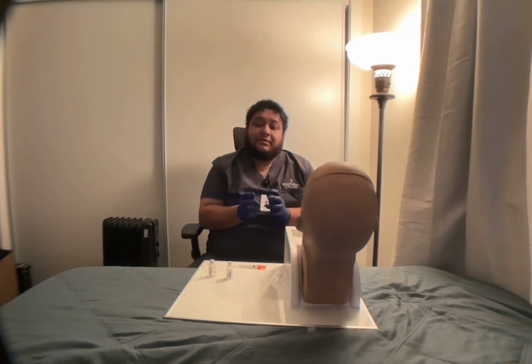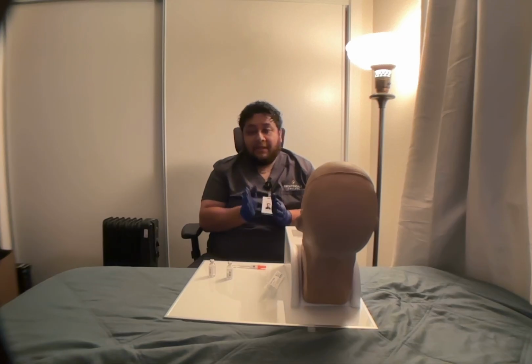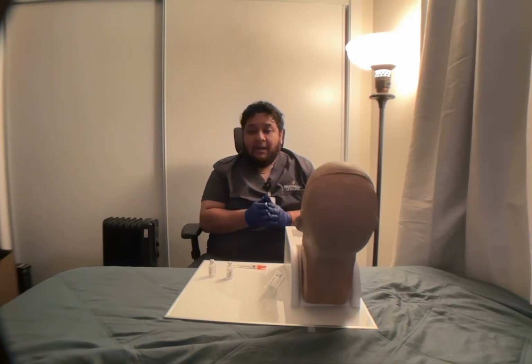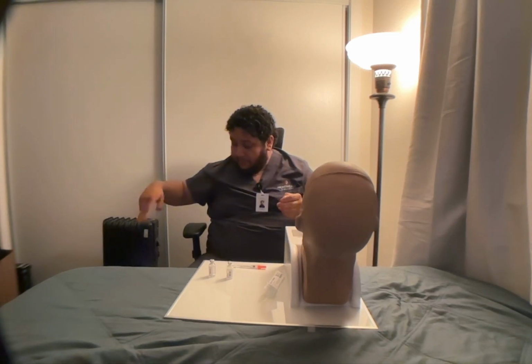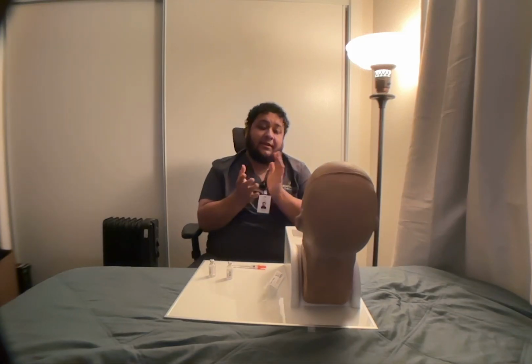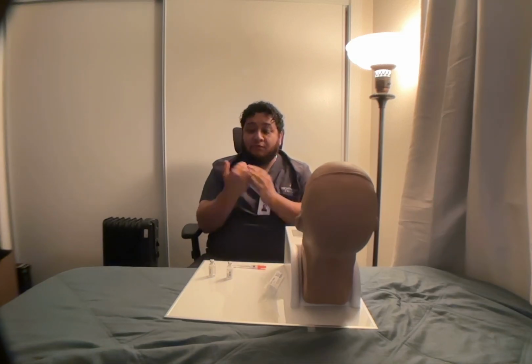Since the insulin was prepared away from the bedside, I'm going to label the syringe with the right name and dose, and dispose of the supplies properly. Then I'm going to remove my gloves and perform hand hygiene. Now I'm going to ensure that the patient is comfortable. I'm going to give him the call light and ask him if he has any other questions for me before I exit the room with my supplies. And I'm going to document.